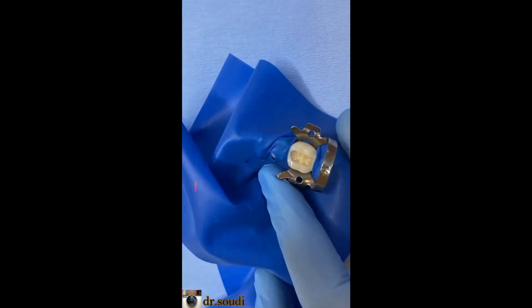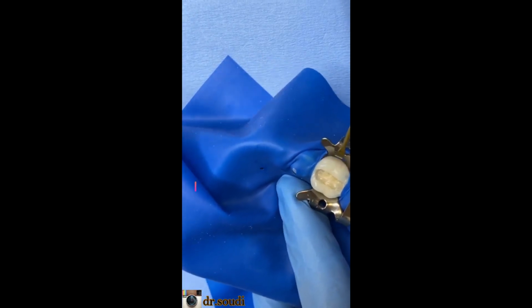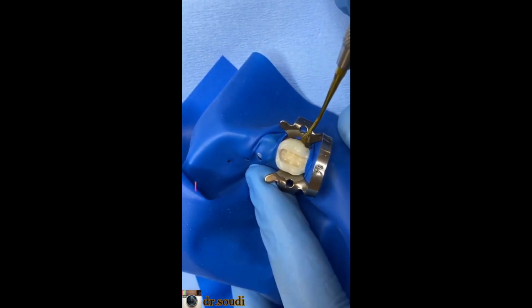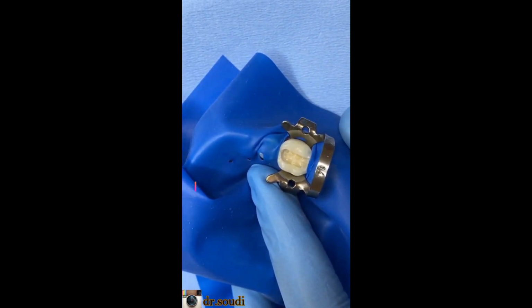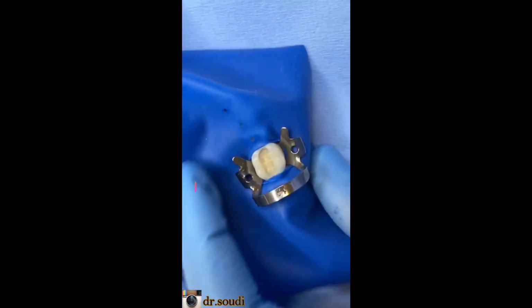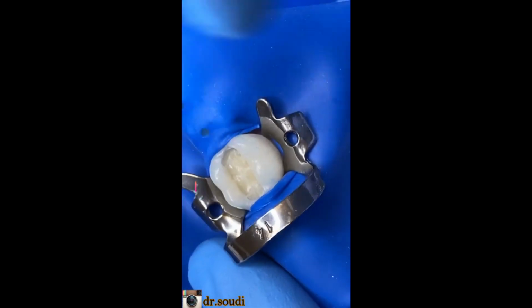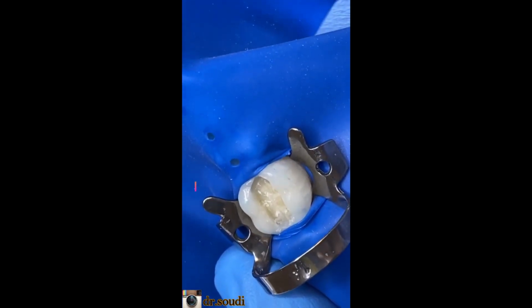Okay, I need you to see this trick. Here, you can see that this area is not fully covered with the sheet, right? This will be a source of leakage. There is something called clamp rocking. Rocking means shaking. How will I cover this area of leakage?